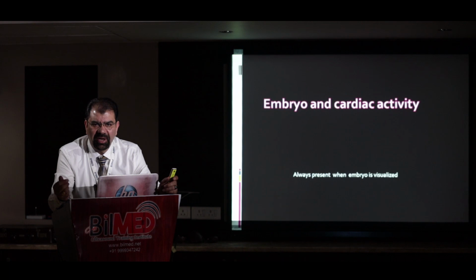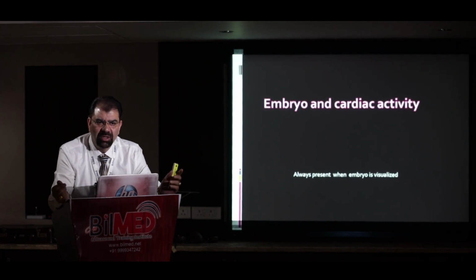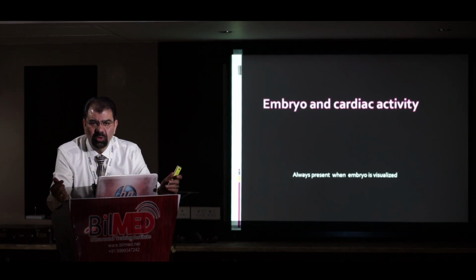Before depth, you have to adjust the transducer's frequency, which is the first thing discussed. You have to decrease your frequency or increase your frequency. If you are increasing your frequency, your resolution is improving. Then adjust the depth. Why scan with 12 centimeters depth?